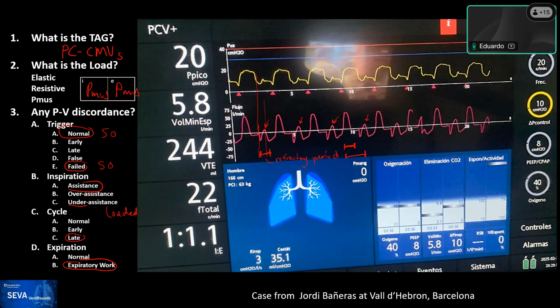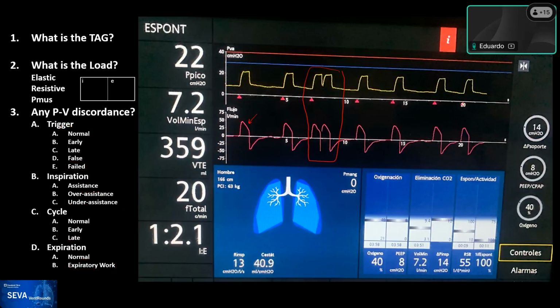Oh, I love that thought. And actually, I would say that many ventilators, and I believe this one also does that, when you have them on pressure support, will tell you the inspiratory time. So it may be a way for you to measure, and actually, instead of guessing, set that value for your inspiratory time when you're in pressure control.